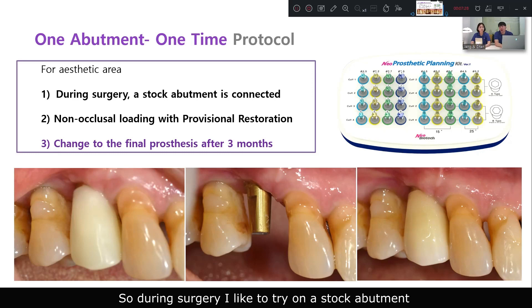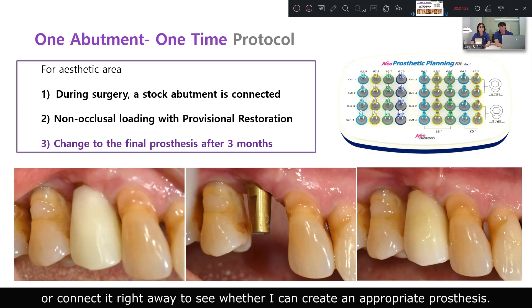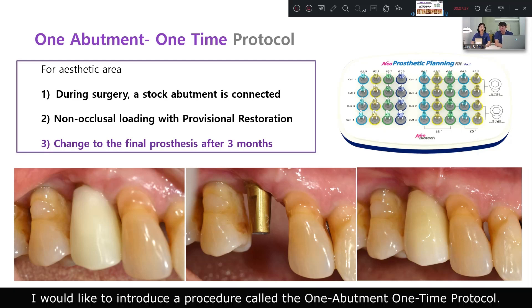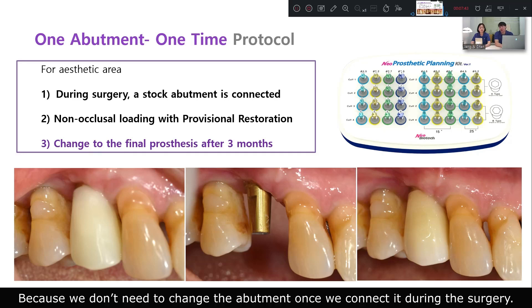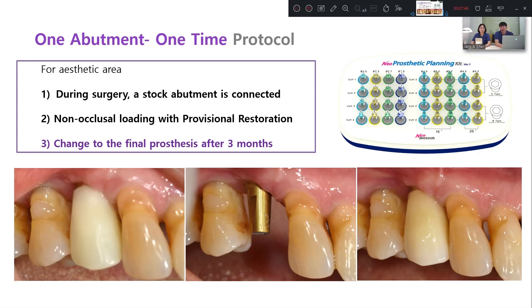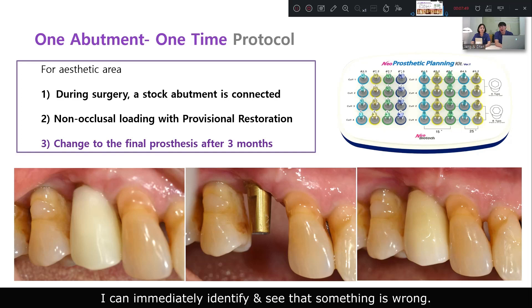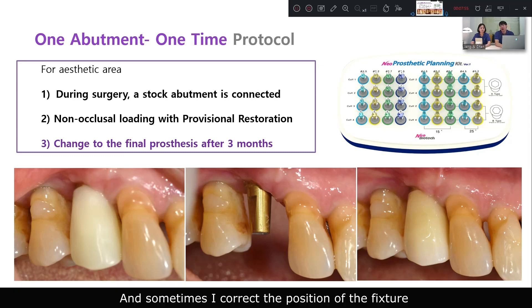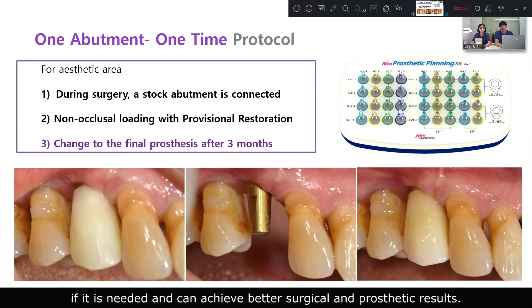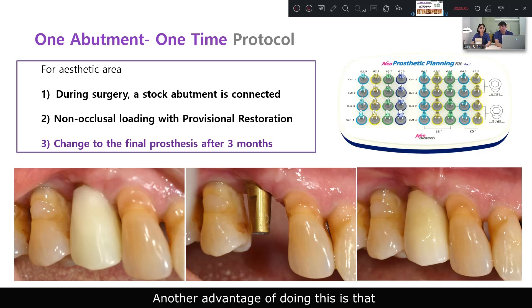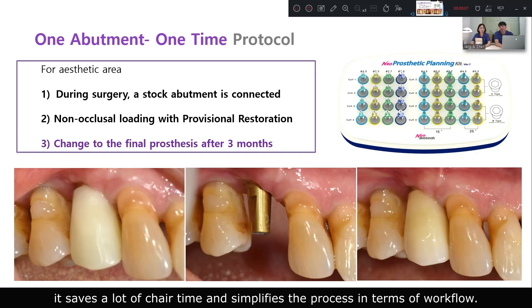During surgery, I like to try on a stock abutment while connecting it right away to see whether I can create an appropriate prosthesis. I would like to introduce a procedure called the one-time protocol, because we don't need to change the abutment once we connect it during surgery. If I choose an abutment of appropriate size, I can immediately identify if something is wrong. Sometimes I correct the position of the fixture if needed, and can achieve better surgical and prosthetic results. Another advantage is that it saves a lot of chair time and simplifies the prosthetic workflow.